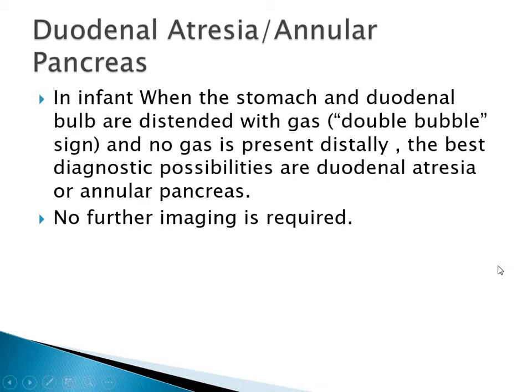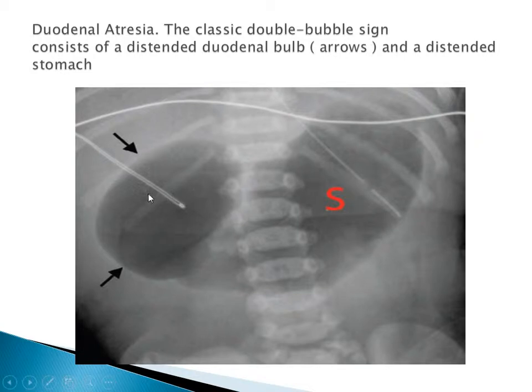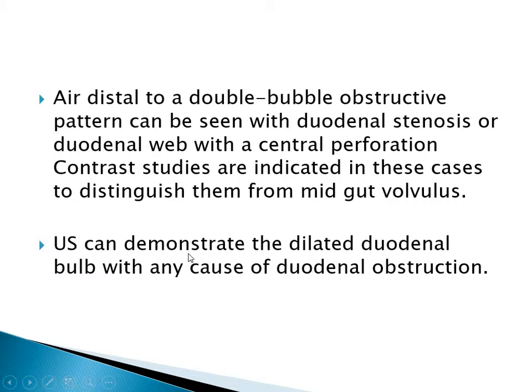If we have a double bubble sign, we have two possible diagnoses: annular pancreas or duodenal atresia, and the vast majority of the time it will be duodenal atresia. In this case of duodenal atresia, we see the classic double bubble sign of the stomach and duodenum. A distal-to-double-bubble obstructive pattern can be seen with duodenal stenosis or duodenal web with central perforation. Contrast studies are indicated in these cases to distinguish them from midgut volvulus.